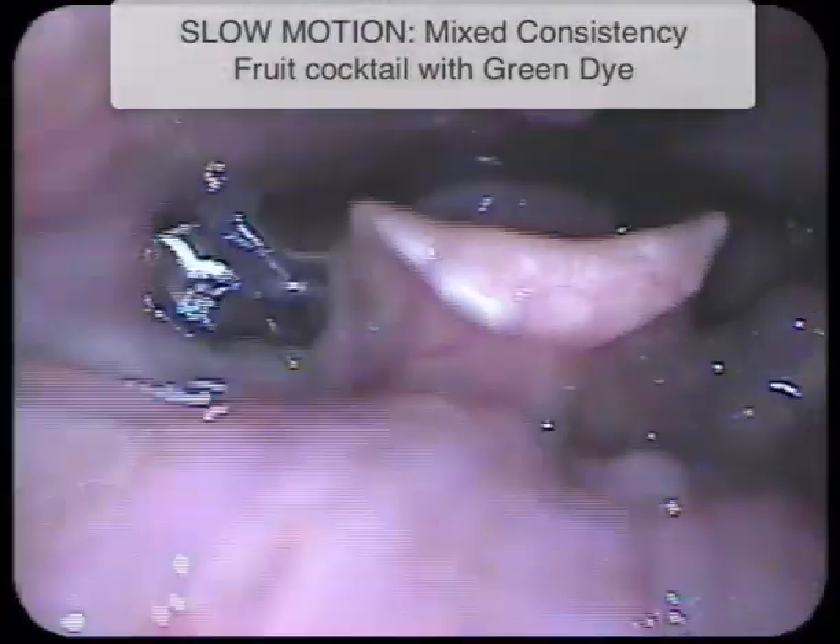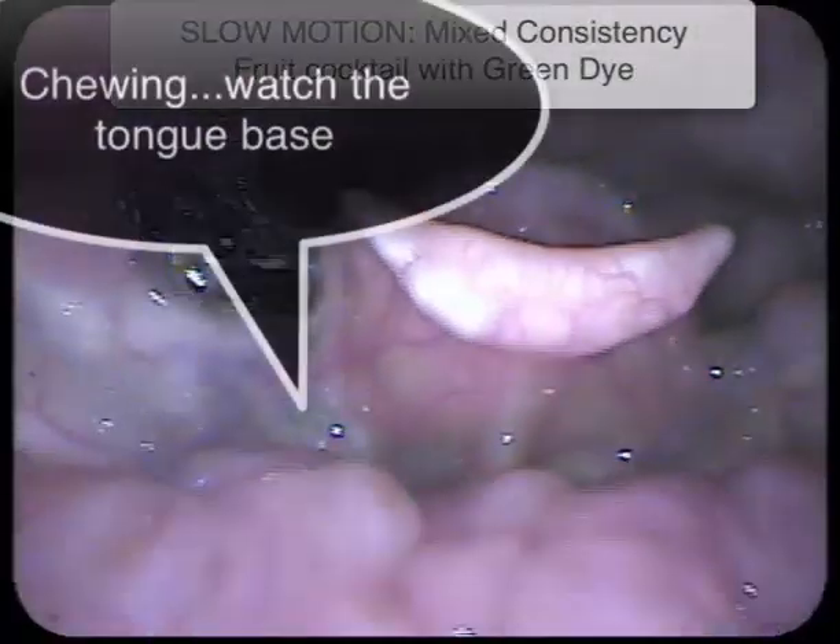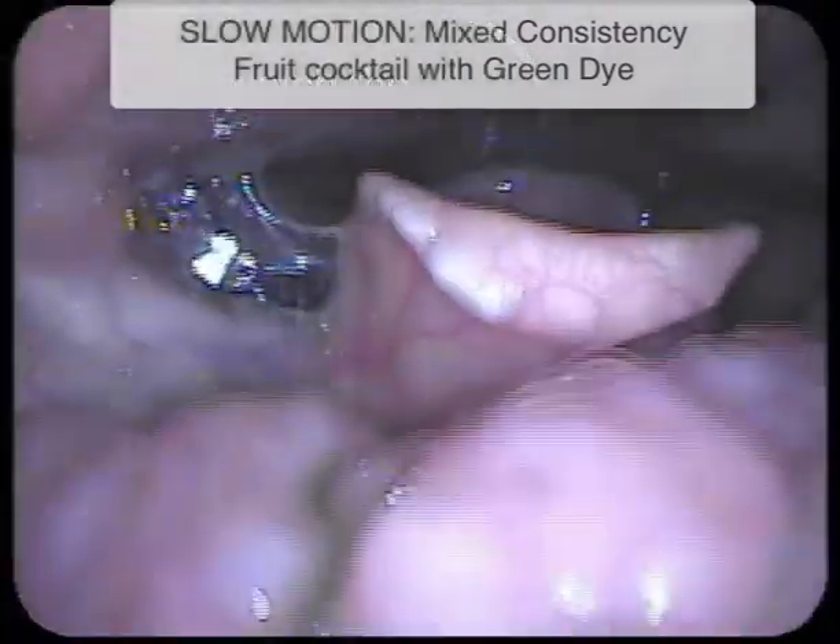Let's see that in slow motion. Notice during chewing how the base of the tongue kind of rocks back and forth on either side.